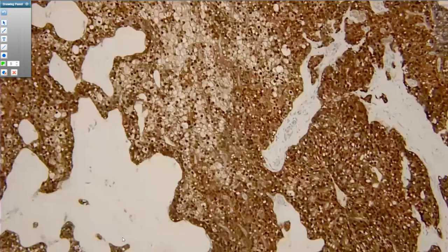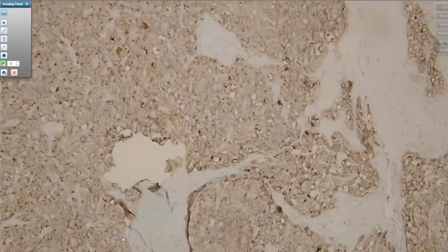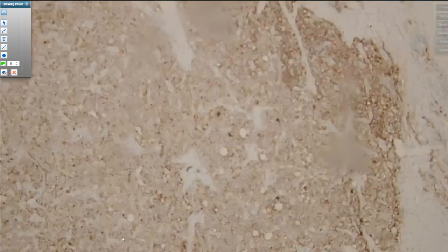Again, that helps with your differential for neuroendocrine tumors. Neuroendocrine tumors won't have that labeling pattern. Solid pseudopapillary neoplasms are also positive for CD10; this is a different tumor example. A pitfall is that they can be positive for both CD56 and synaptophysin, which can cause some difficulty if you're considering a neuroendocrine tumor, but they'll be negative for chromogranin, which should help distinguish those two entities.